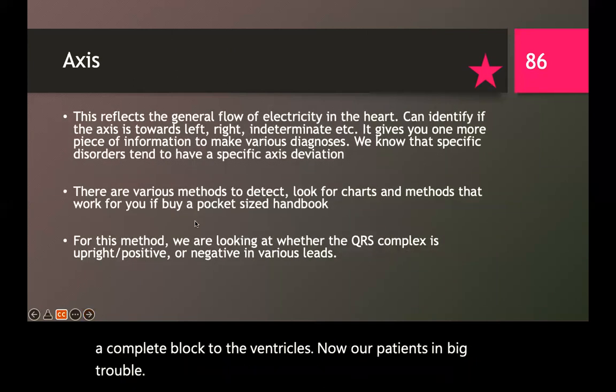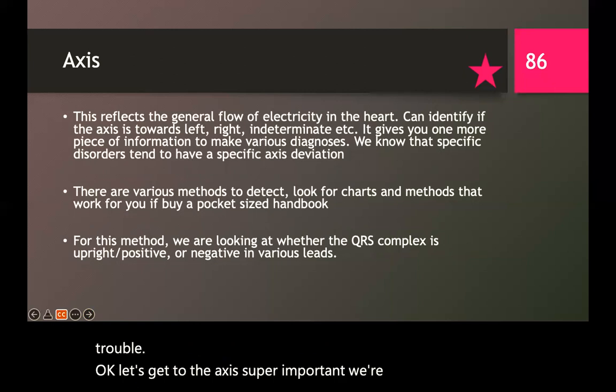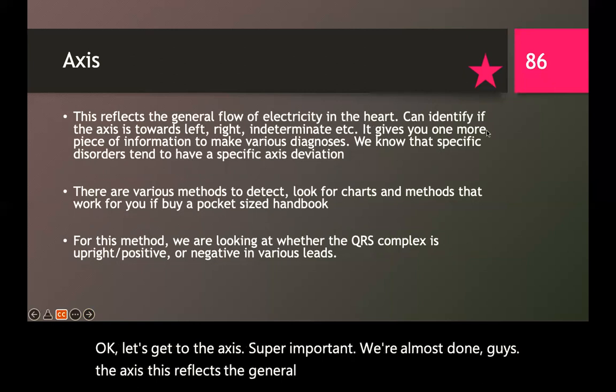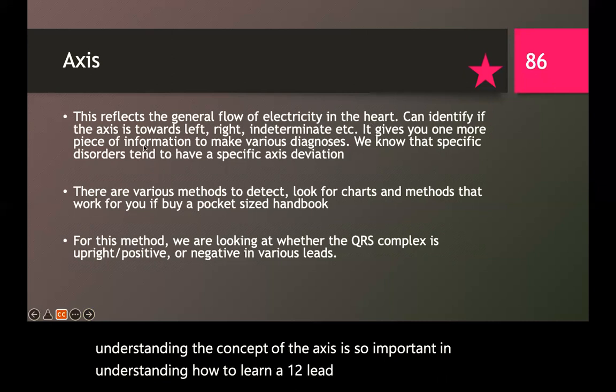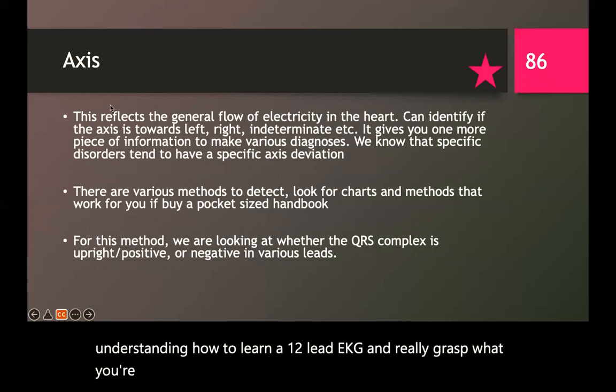Okay, let's get to the axis. Super important. We're almost done, guys. The axis reflects the general flow of electricity in the heart. So understanding the concept of the axis is so important in learning a 12 lead EKG and really grasping what you're reading. Okay, so just keep that in mind.